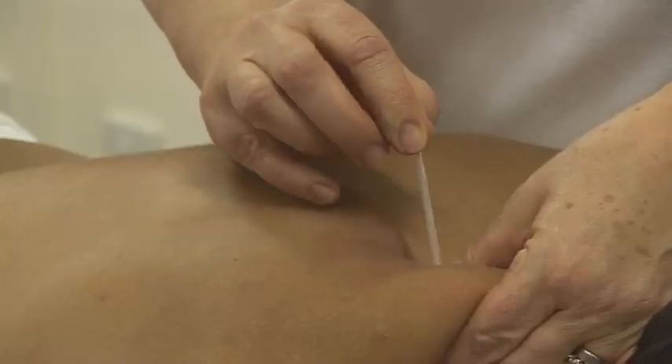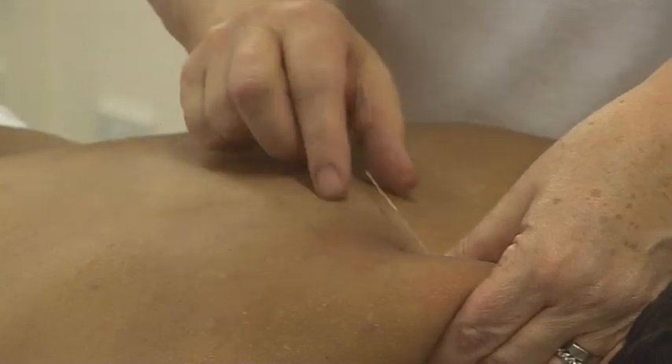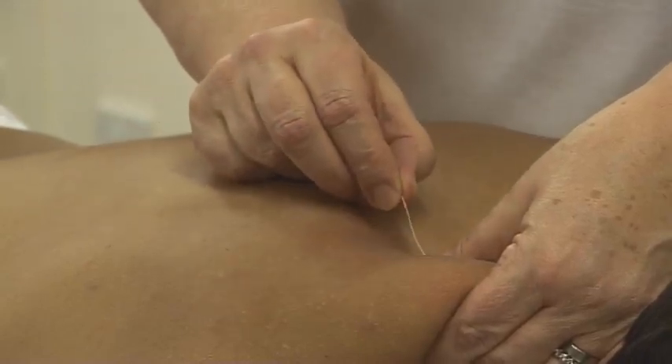When needling this trigger point, it is important to keep hold of the muscle at all times in order to avoid any possibility of puncturing the apex of the lung.